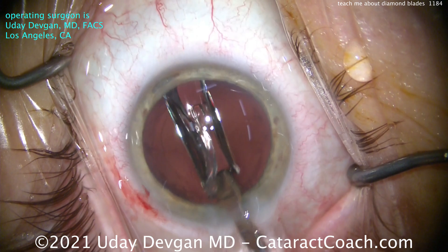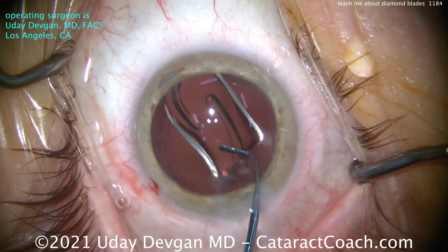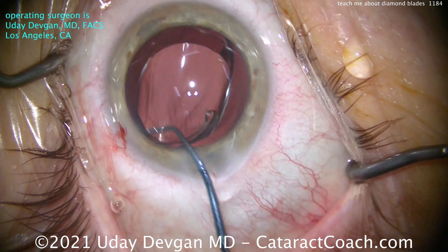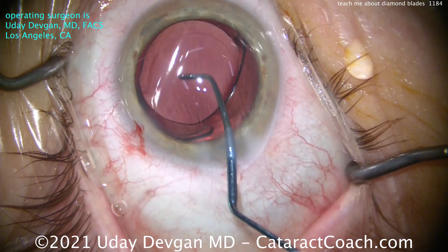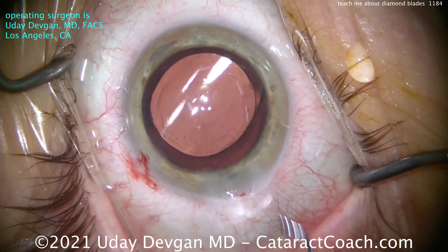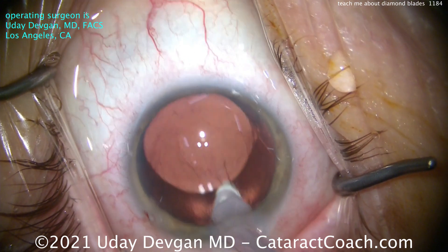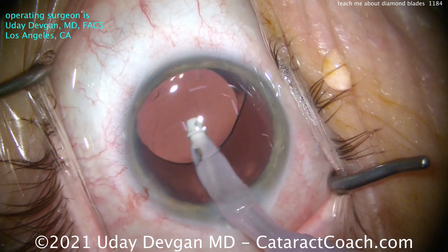There are some disadvantages. Diamond keratomes are super fragile — these things are incredibly thin. If you touch the tip of a diamond keratome with a steel or titanium instrument, you're going to chip it and damage it. Diamond keratomes are also really expensive — you're looking at a minimum of $5,000 per diamond keratome, maybe even $6,000, $8,000, or $10,000 for one instrument.